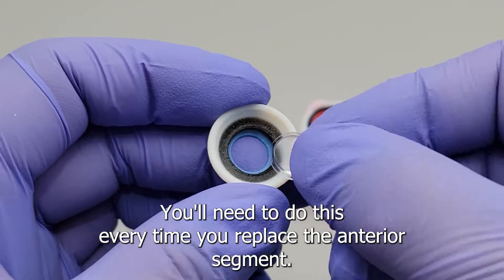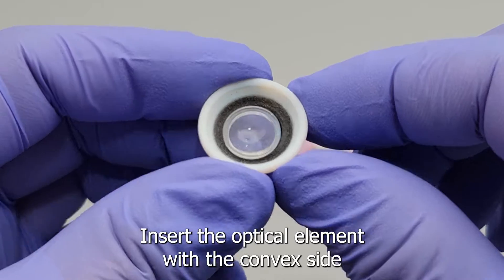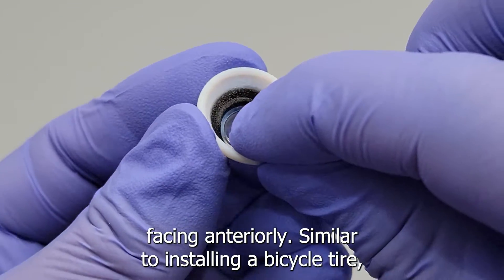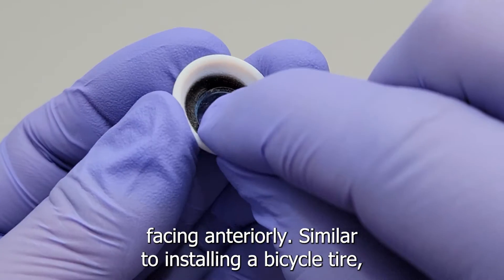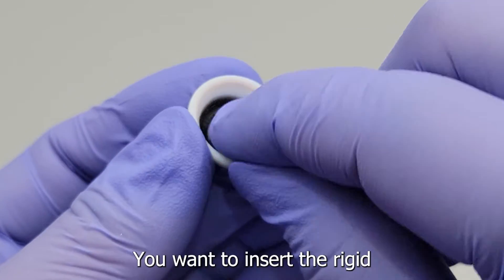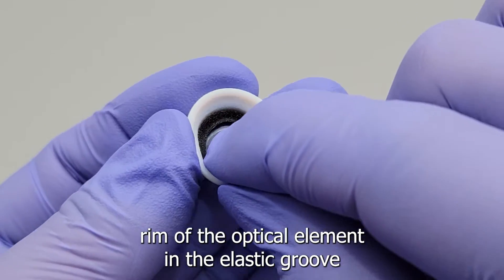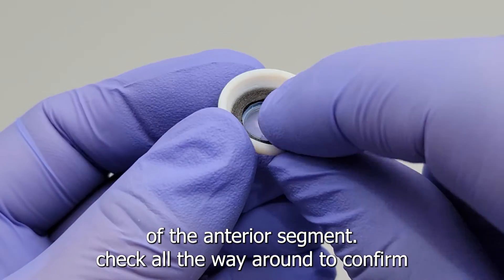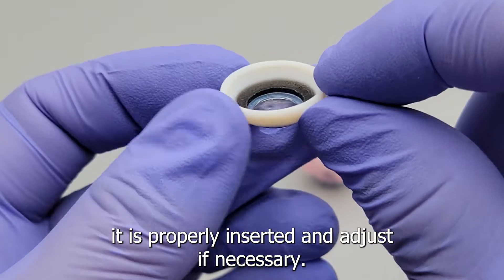Now let's assemble the anterior segment with the optical element — you'll need to do this every time you replace the anterior segment. Insert the optical element with the convex side facing anteriorly. Similar to installing a bicycle tire, insert the rigid rim of the optical element into the elastic groove of the anterior segment. Check all the way around to confirm it is properly inserted.